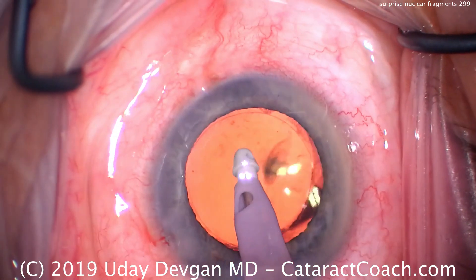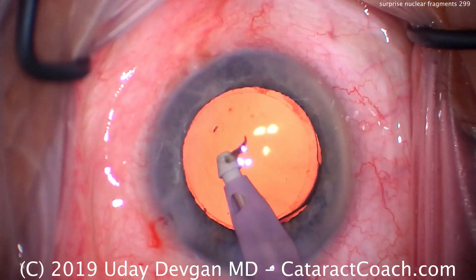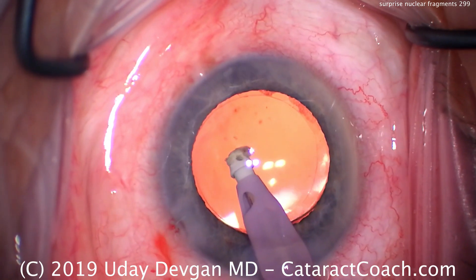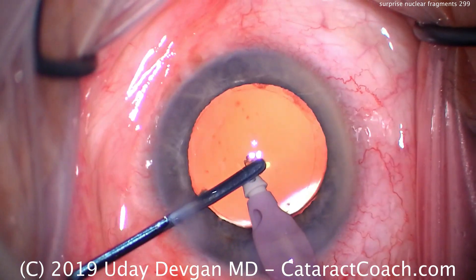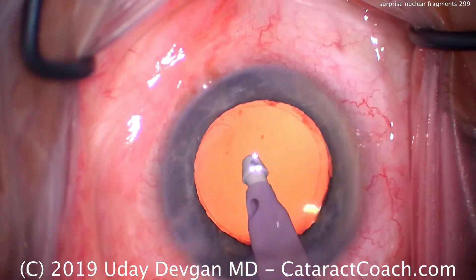That's just to really wash out the anterior chamber. Look at those two surprise pieces — they came out of apparently nowhere. They were stuck under the iris in that sulcus, and we didn't see them. But when we have all this fluid flowing through the eye, that helps wash it out.